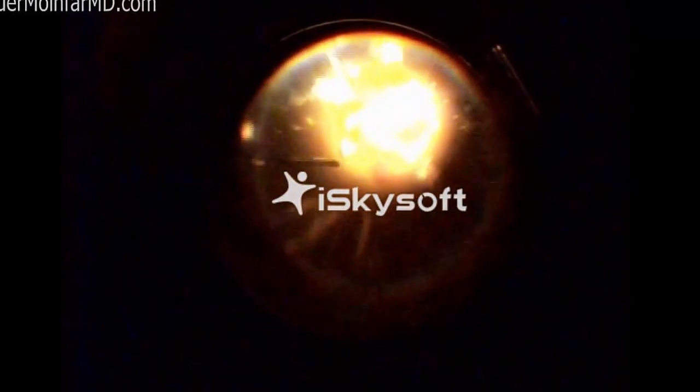Now typically, getting back to the configuration in the operating room, there's a screen that projects what I see for the benefit of the other personnel in the operating room. Typically there's a scrub nurse that is in sterile clothing who hands the surgeon the instruments, and there's also someone called a circulating nurse, which is a registered nurse that basically prepares any medications that we need during surgery, and also is basically there to hand over equipment from the storage area or the sterile supply. So basically projecting it onto the screen helps keep all parties engaged as to what is going on.